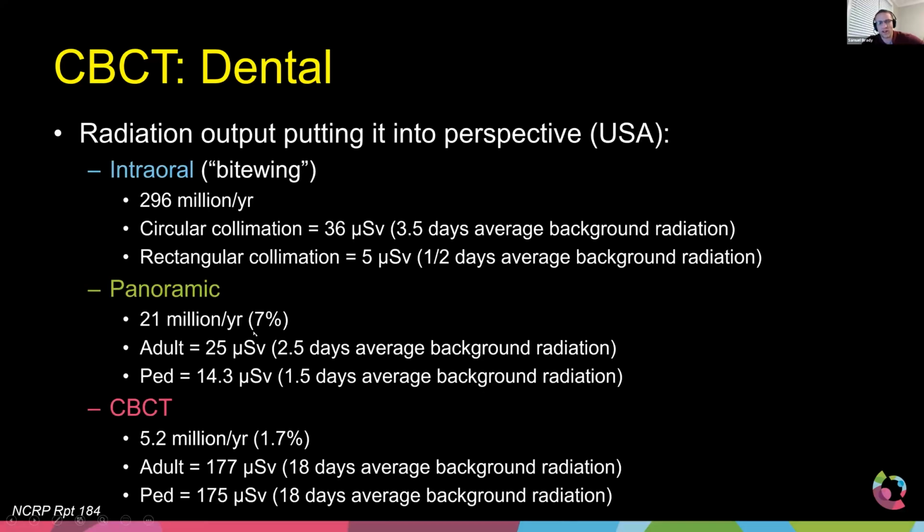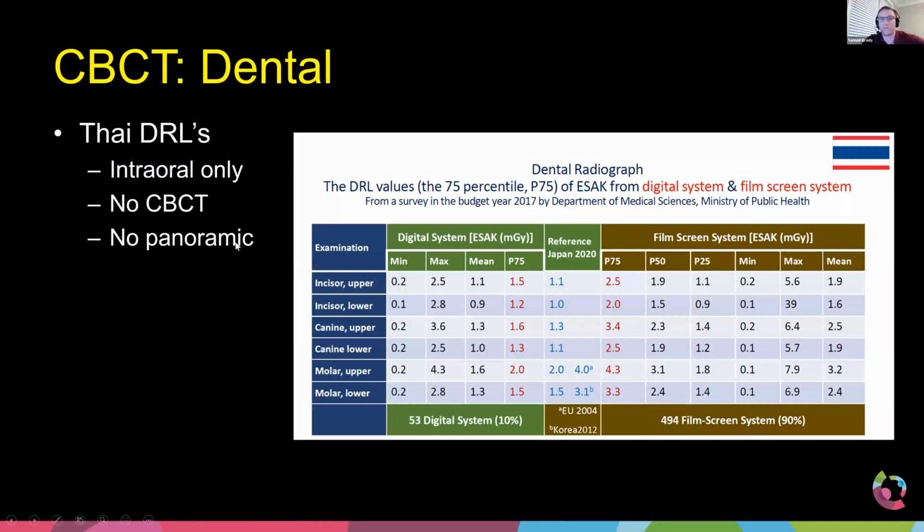So when we started tracking these numbers back in 2016, that's when we started to realize the discrepancy, for example, the CBCT there is no dose reduction or any dose optimization for kids. And these doses are obviously much higher than the intraoral. And so starting to collect the data is very helpful. You might not actually publish DRLs anytime soon, but you should start sending out surveys.